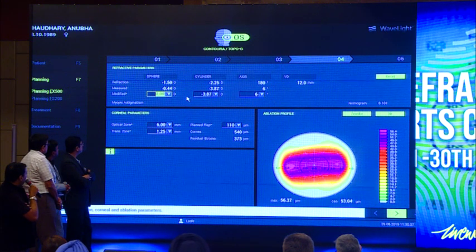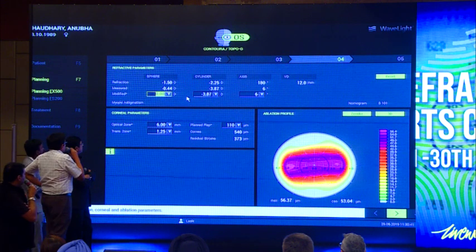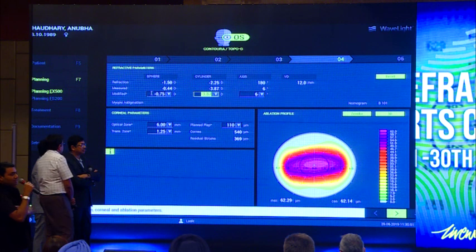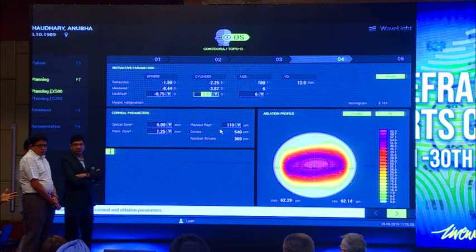And now, how much do you change, sir? Half the difference between these two. Half is 1.25, that becomes 0.75. So you have to take 0.75 off. And with the nomogram, yes, 1. This is Dr. Ramamurthy's way of doing a TMR. Anybody has doubts, questions on this?